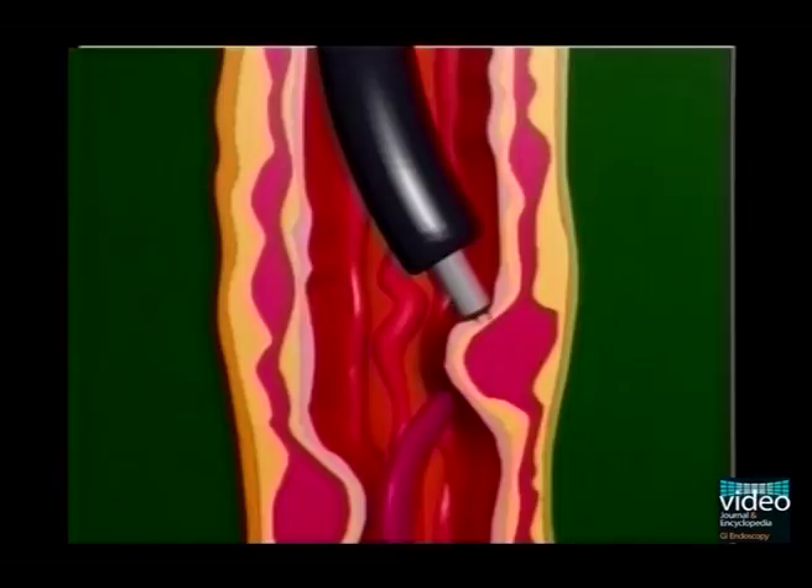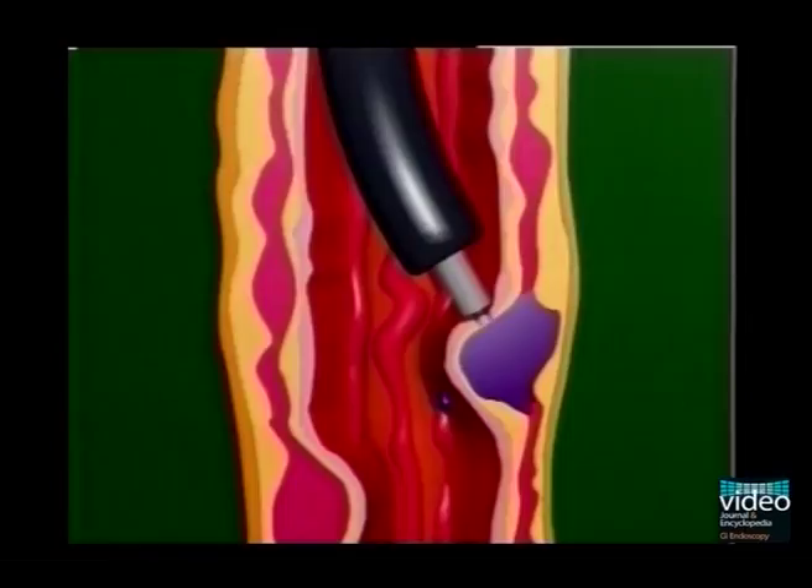First, we demonstrate the principle of N-butyl-2 cyanoacrylate injection. It is crucial to inject the glue mixture strictly intravariceally to obturate varices.